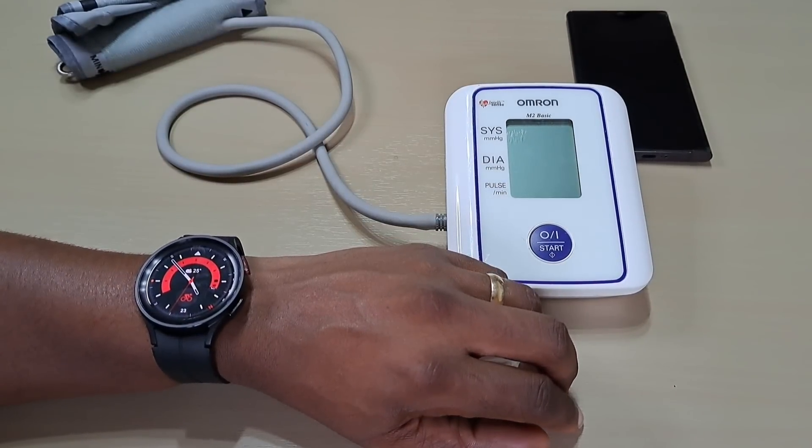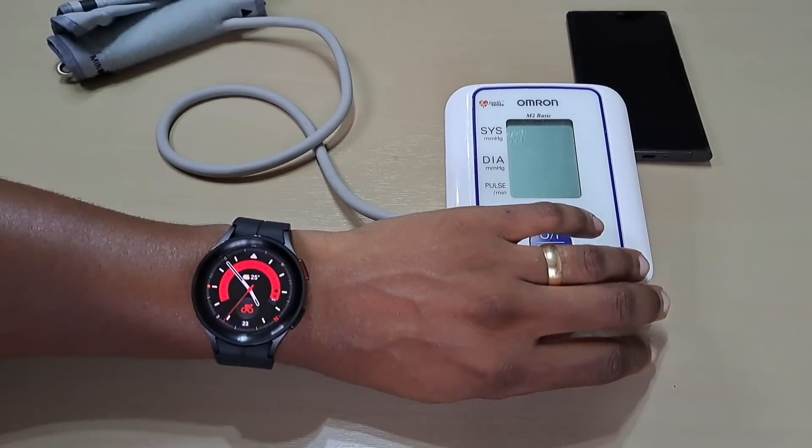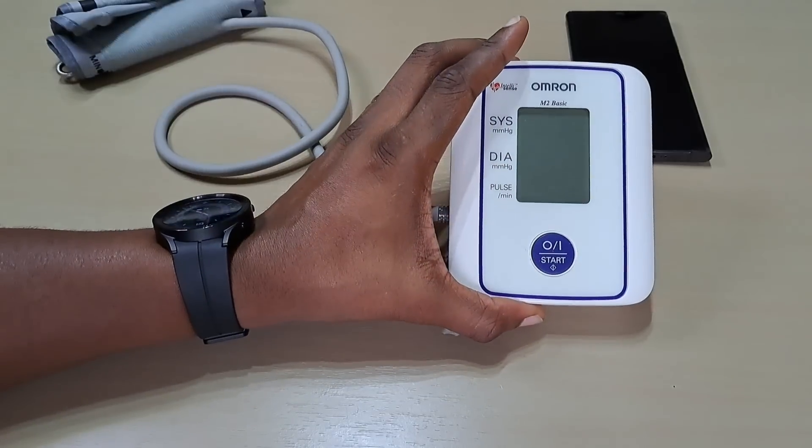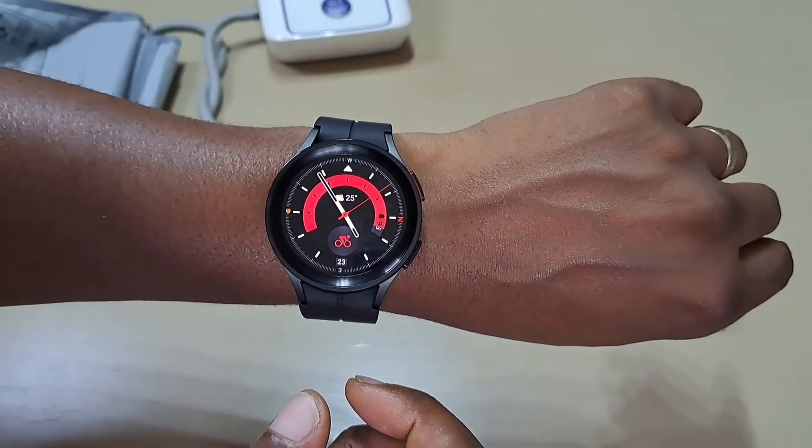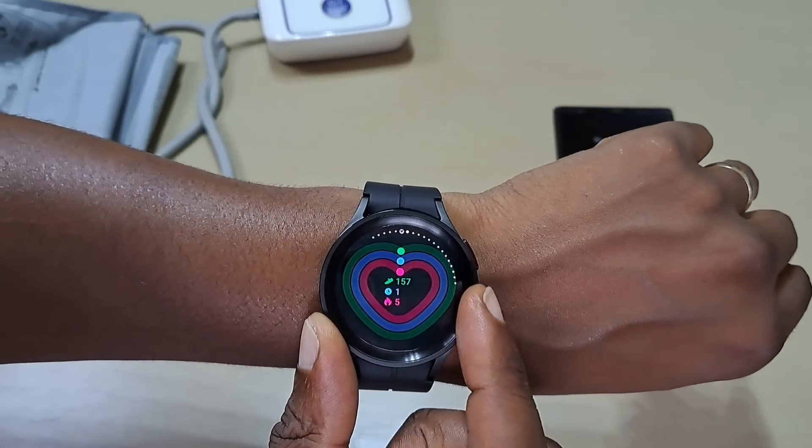Welcome back to another video guys. This one will be calibrating the Galaxy Watch 5 Pro with the blood pressure monitor. On the Watch 5 Pro, let's go to the blood pressure.